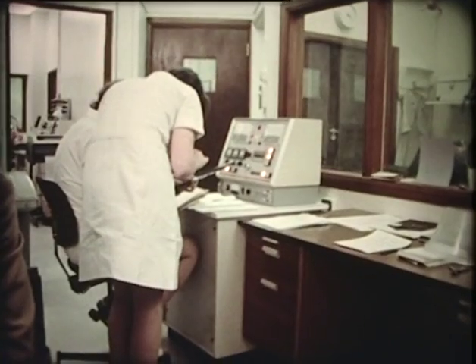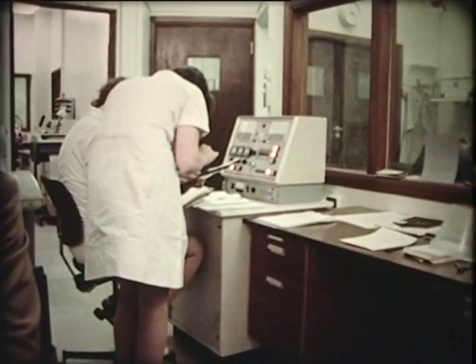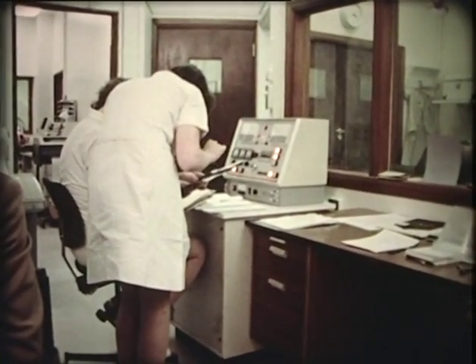Now the scan here tells us, it explains her condition, but also it's clear that this is a condition which does not require surgical treatment. And so this is very important in the management of this patient.